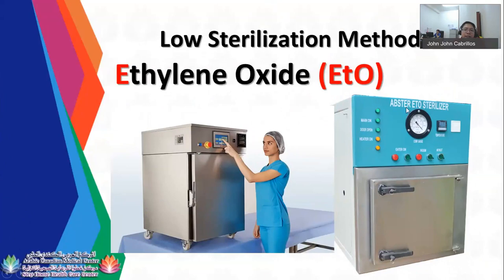So low sterilization methods, ethylene oxide gas is one of your samples. This is your ethylene oxide sterilizer. So there are times that your ethylene oxide machine looks the same as your autoclave. So you need to check if it is an autoclave or if it is ETO or hydrogen peroxide. Okay.